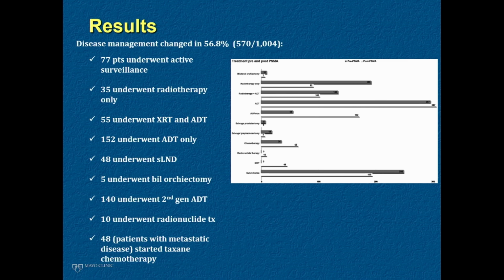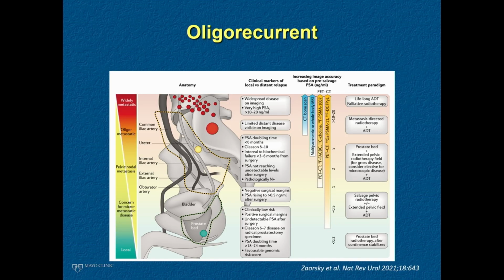And I think that's also reflective now in our salvage prostate cancer guidelines from the AUA, SUO, and ASTRO. I've mentioned this, it's shepherding this oligo-recurrent state. So men have had a radical prostatectomy, develop biochemical recurrence, get a PET scan, and are found to have recurrent disease and potentially oligometastatic disease, which has various definitions, whether you want to use 3 lesions, 5 lesions, it's rapidly evolving.